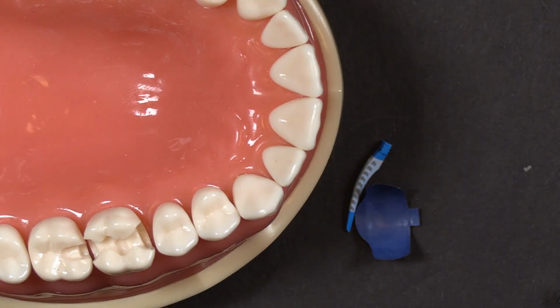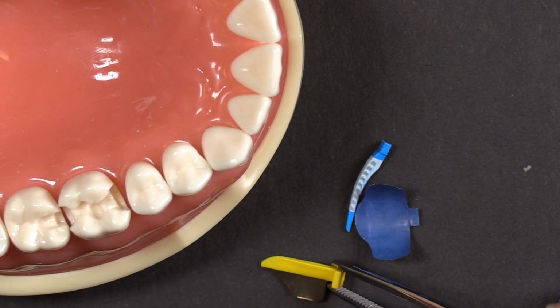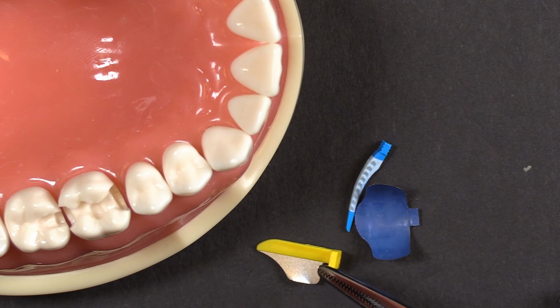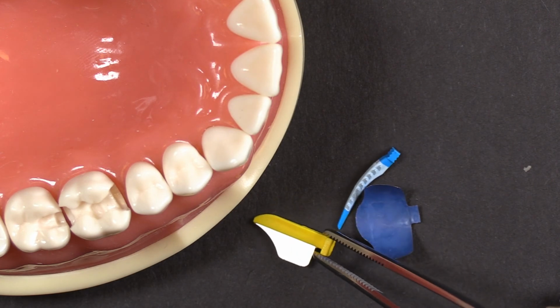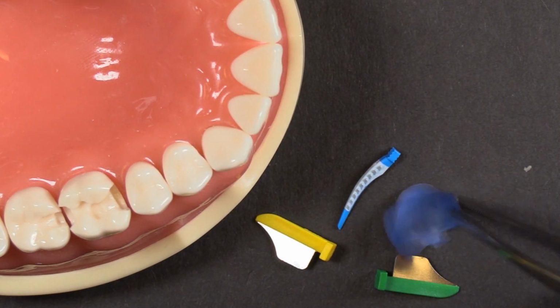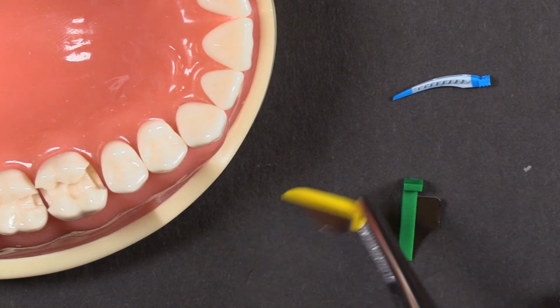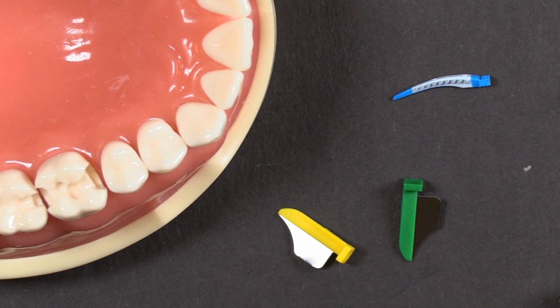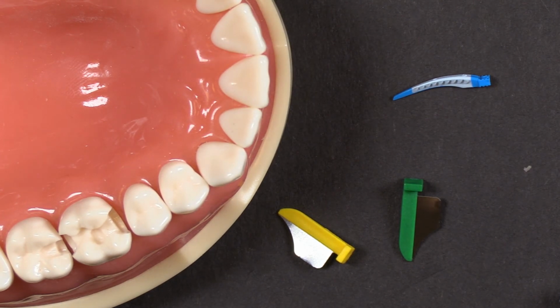Their concern was, when they attempted this, when they pulled the fender wedge out, and this is a fender wedge, okay? It's got a plastic wedge with a protecting metal shield extending from it. It's designed to prevent the burr from contacting the adjacent tooth during the preparation. Like all of the wedges, there are different sizes. My suggestion to the write-in person who was still unable to get the matrix band in after using a fender wedge was, perhaps you did not use a large enough fender wedge.